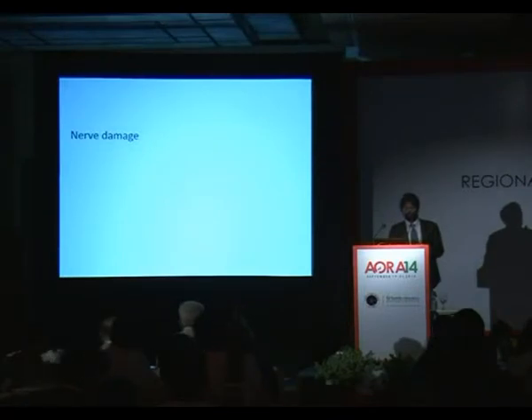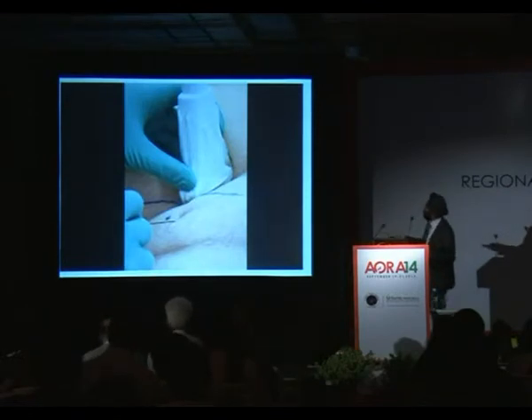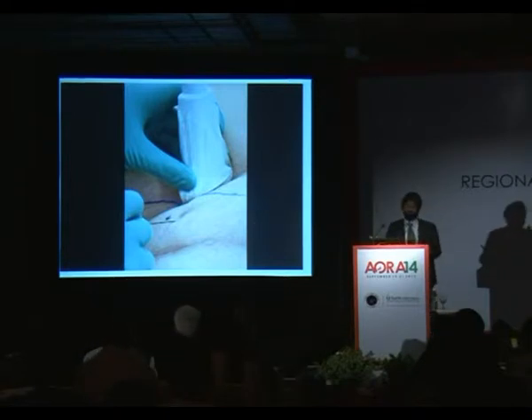Chance of nerve damage? I would say that's pretty negligible. If you go back to that slide, this is quite an obese patient, and that point is almost the same point you would use for a landmark technique. And your femoral nerve would be somewhere here. If I put my probe in the same plane as the last speaker was using for the femoral nerve, the needle would normally not even come into the picture because it is about 2.5 inches away.